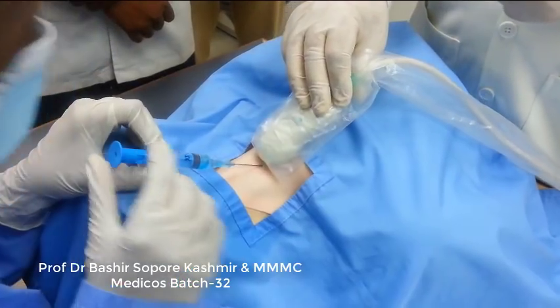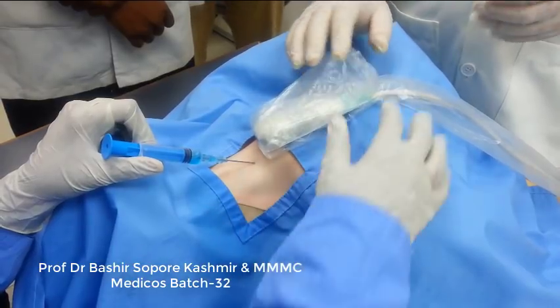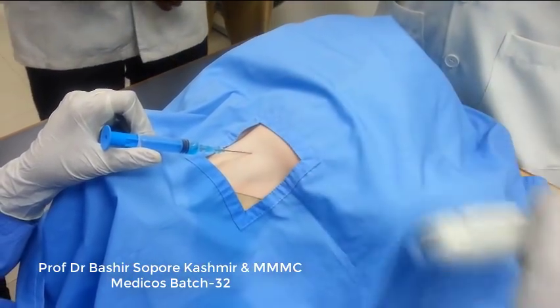So this was all about how to do the central venous catheterization by ultrasonography, right?